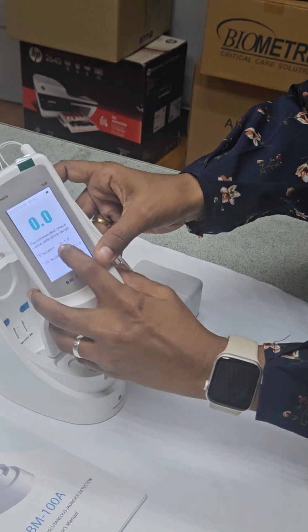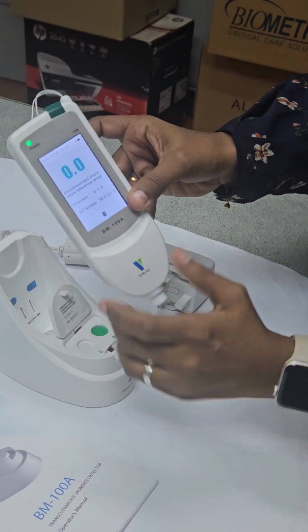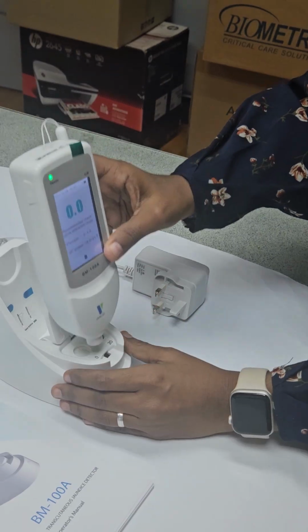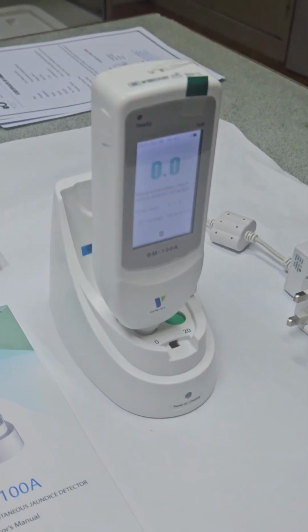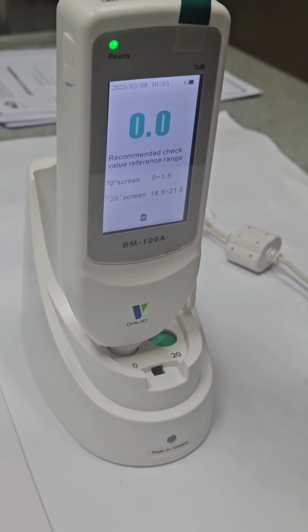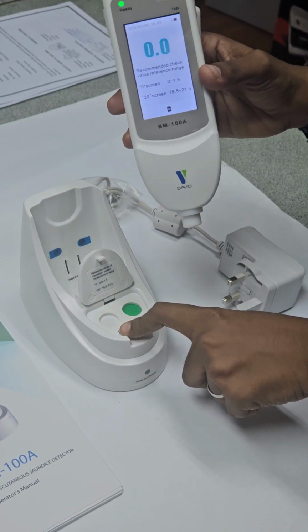So the 0 screen, the range should be 0 to 1.5. The 20 screen is the green screen here, 18.5 to 21.5. So okay, you have to leave it this way. You have to place it in a vertical way. Then the result is 0 in the 0 screen, the white screen.